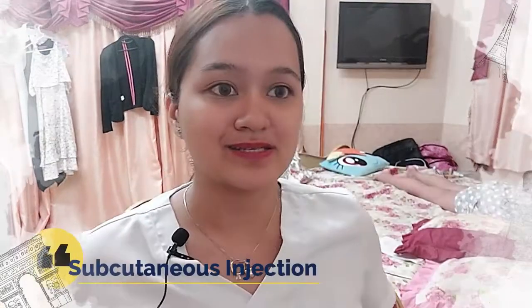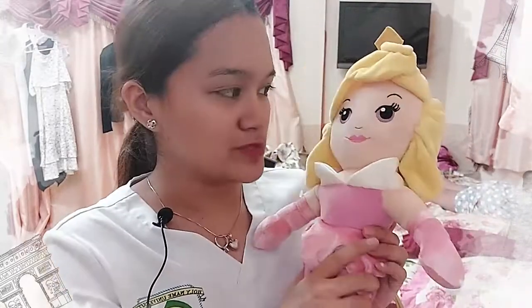For a subcutaneous injection, I need to provide privacy, do hand hygiene, and may or may not wear clean gloves. Identify my client — Ms. Aurora, hello, how are you feeling? Explain the procedure: I'll be giving you a subcutaneous injection. She can be positioned in a supine position. I need to prepare my materials: I can use the 25 gauge needle size for subcutaneous, and a 1ml syringe. Draw out one milliliter from an inverted vial. I don't need to aspirate for this. Double-check the right drug, right dose, time, date, and route — subcutaneous.